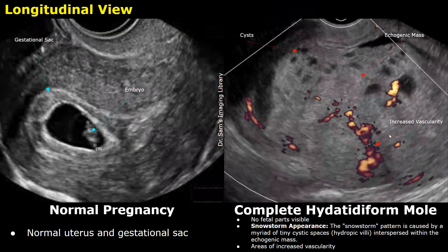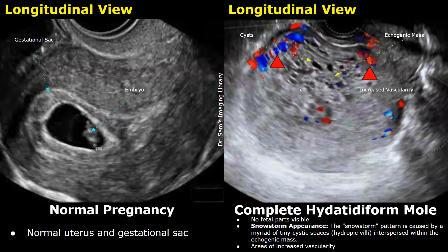Doppler features of a molar pregnancy are variable, but in typical cases, areas of increased vascularity are seen. In this image, power Doppler is applied — you can see Doppler signals within the echogenic mass, suggesting areas of increased vascularity. In this next image, color Doppler is applied, and you can again see areas of increased vascularity within the echogenic mass.